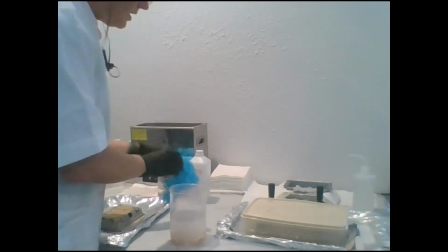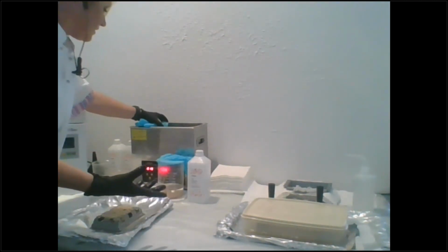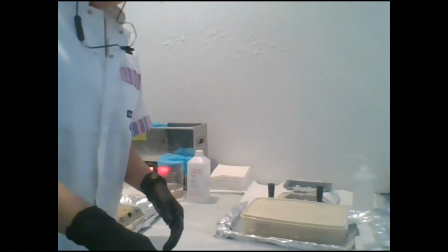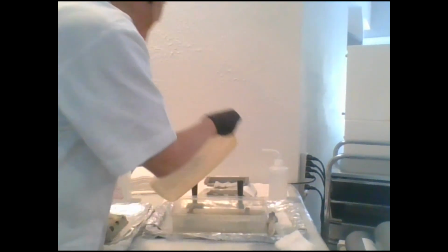and then I'll show you what I do. I use this glove. You might have caps for yours. I just don't like the smell of alcohol. I don't have an exhaust here. And it goes in for 3 minutes. Okay, and then while that's in the ultrasonic, I use this Tupperware container.